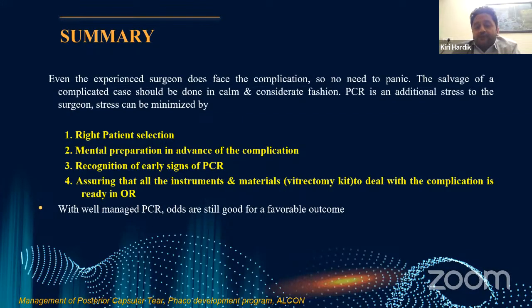Ensure that all the instruments are available, the vitrectomy is available, and the 3-piece lens is available. At your one command, all the things should be available, and your technicians should also be well trained in such cases to manage things.